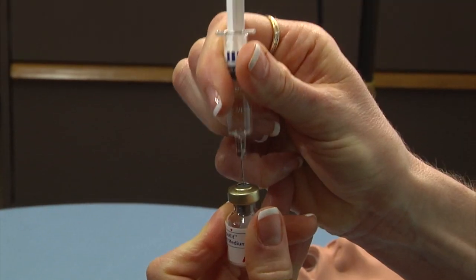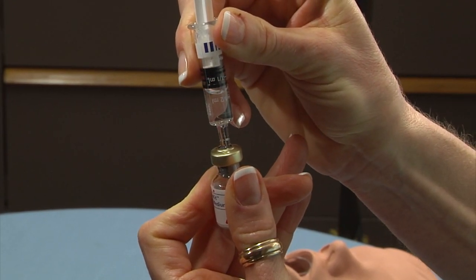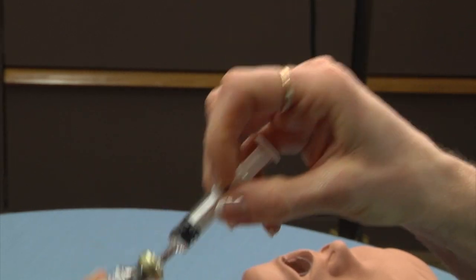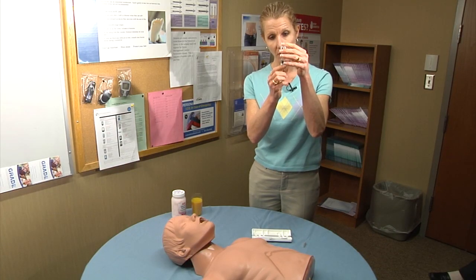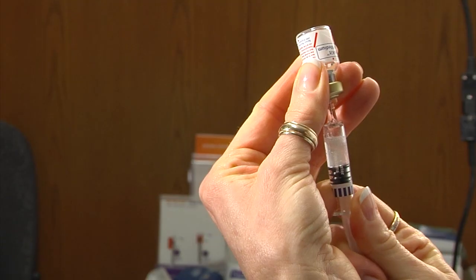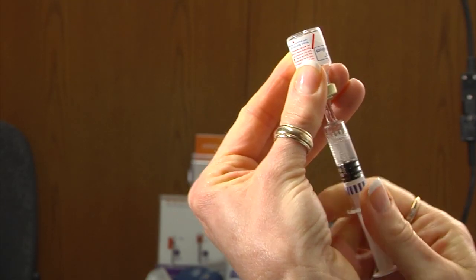Then you want to inject the solution into the vial and swirl it around until you see that the medication has dissolved and it becomes clear. Then turn it upside down and draw the solution back into the syringe until you've gotten all of it out of the vial.